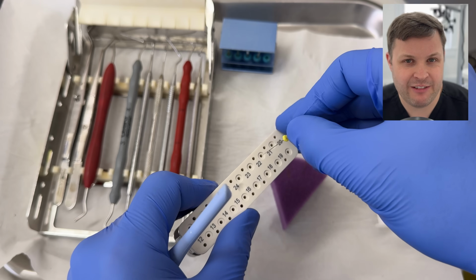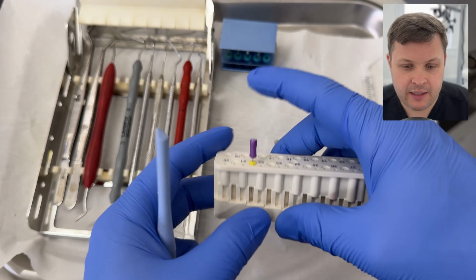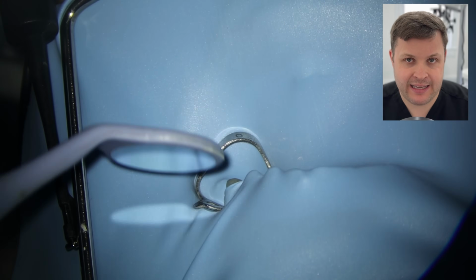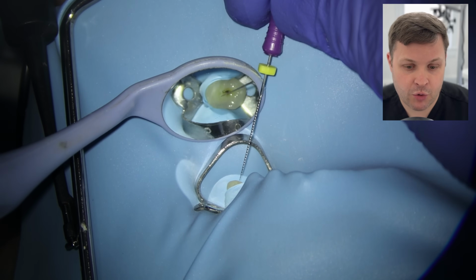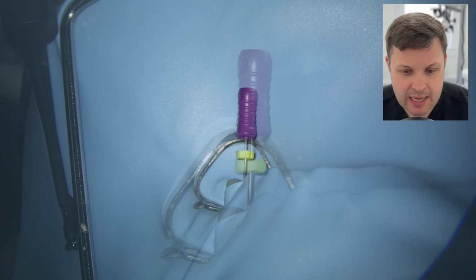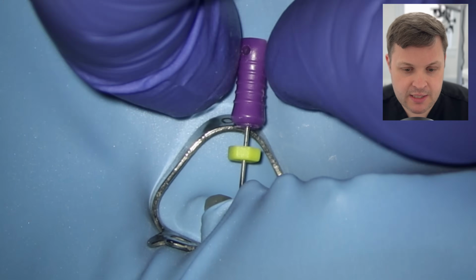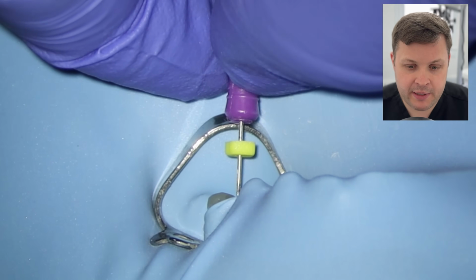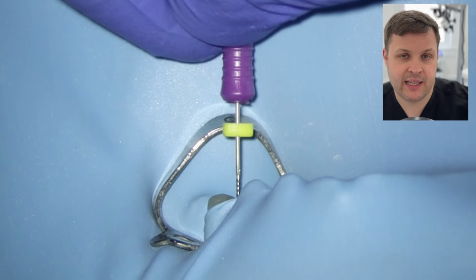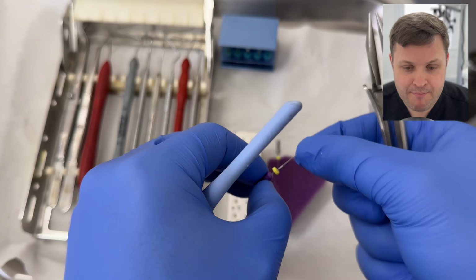So again, we're really near to the end. I'm just going to use a size 10 to about the same amount to try and increase the size of this coronal to mid-third in the buccal, just to give it a little bit of a shape. But as I push this size 10 K-file to length, I'll notice that as I move it up and down, I'm getting a ledge. So I'm not getting even close to 21.5 millimeters like I did with the size 8. And the worst thing to do now is to make the ledge worse.